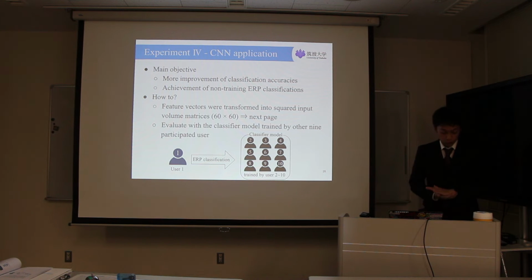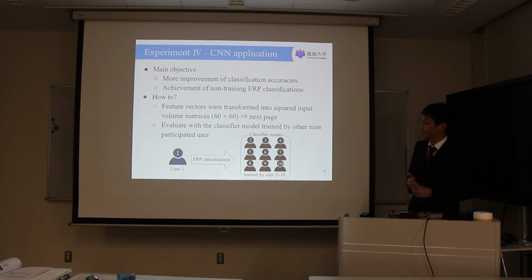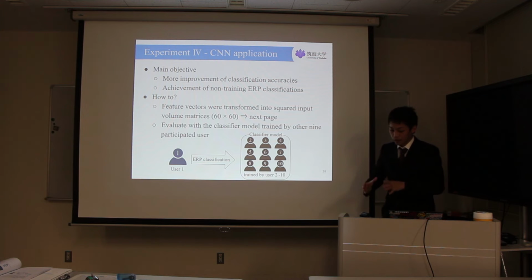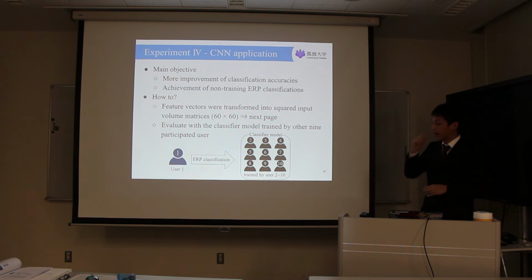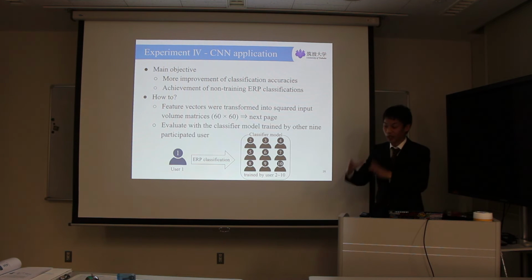And this is the new purpose of this experiment: to achieve non-personal training ERP classification. So this means that in the previous experiments, each subject needed to generate the classifier models. For example, user number 1 needed to create a classifier model for user number 1.